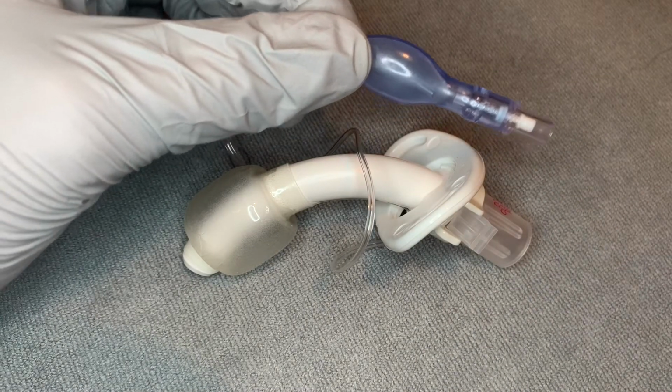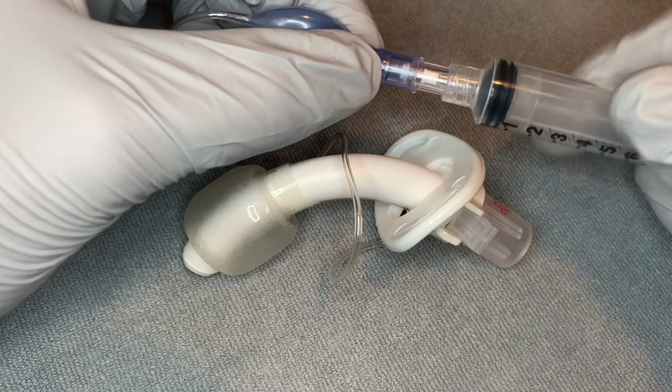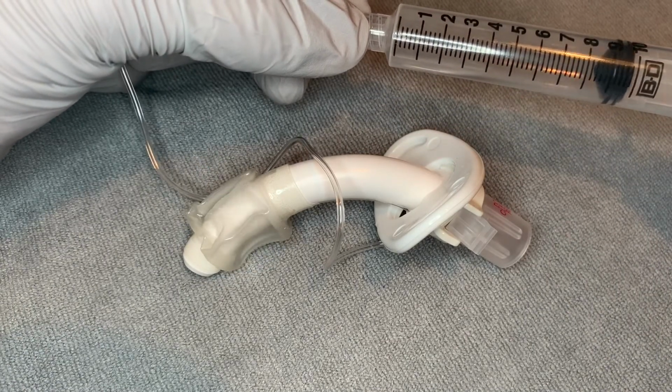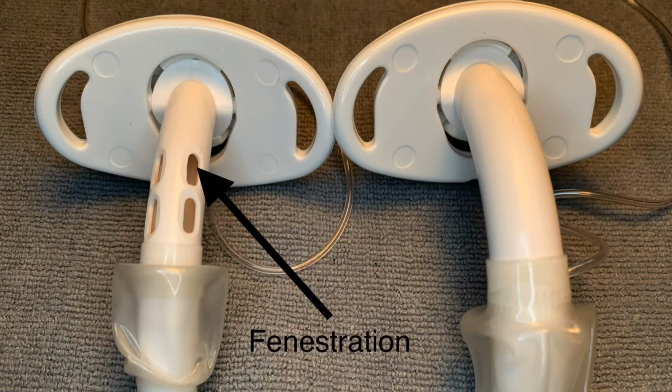Some cuffs are inflated with air and others are inflated with sterile water. If you go home with a cuffed tracheostomy tube, your packaging should instruct you on what to use. Many patients transition to one without a cuff as they recover, often labeled as uncuffed or cuffless, the latter sometimes abbreviated as CFS. There are additional variations in tracheostomy tubes.